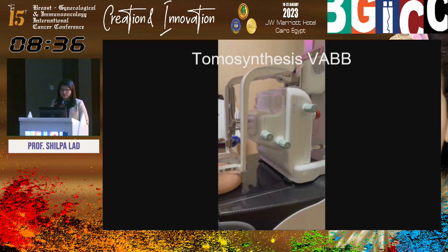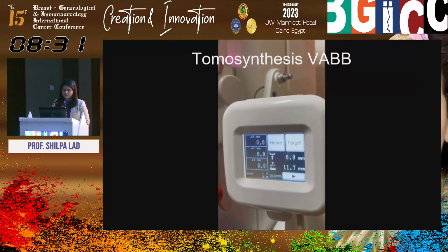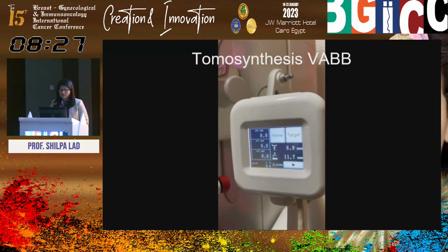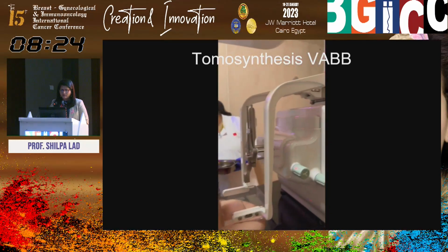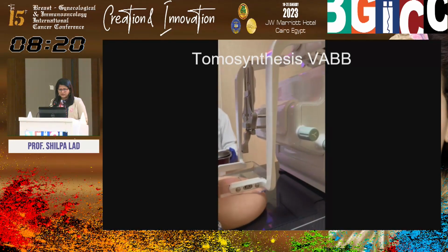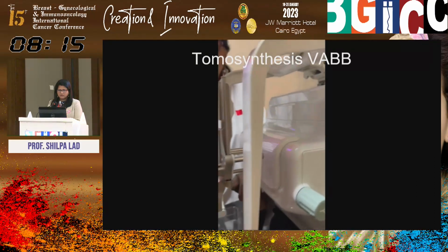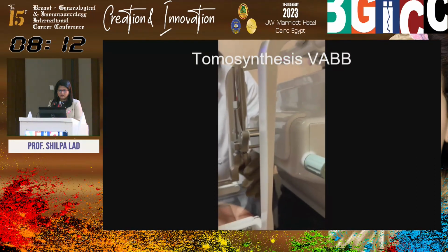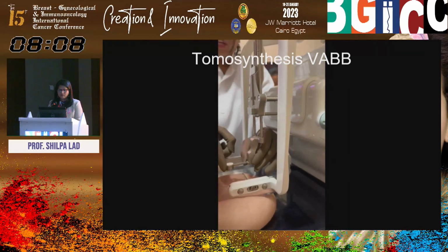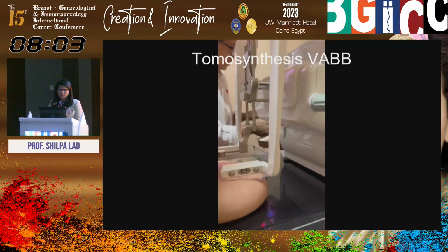Now once we know everything is zeroed, and how do we know that? On the screen, the target shows us that the X, Y and Z coordinates have been zeroed in. Okay, once all this has been zeroed in, then we do our next steps forward. We attach the guide that we need for mounting our 10 gauge needle. Okay, so this guide has been attached. Okay, and we bring the guide approximately to the spot where we are going to target.